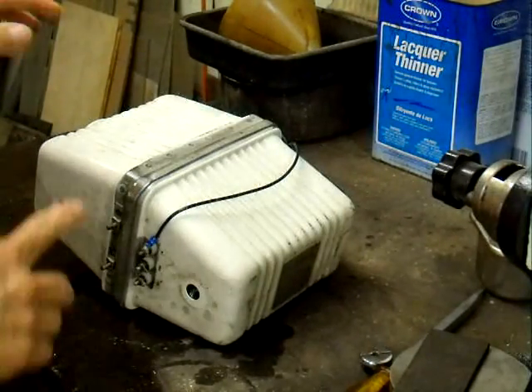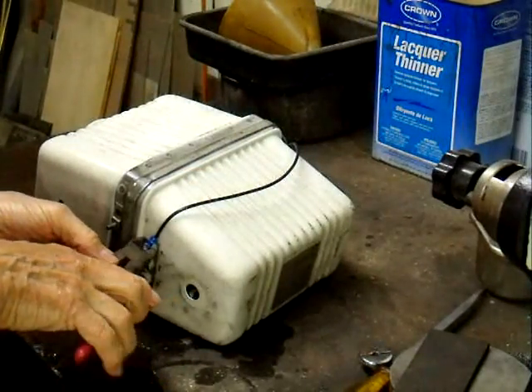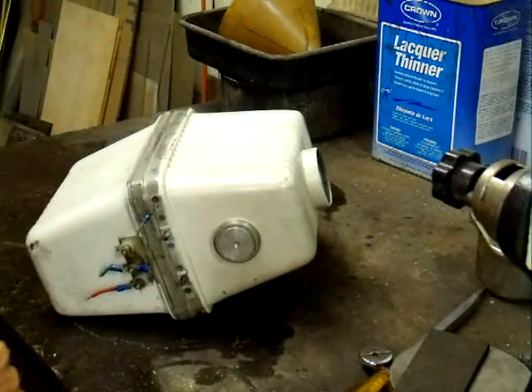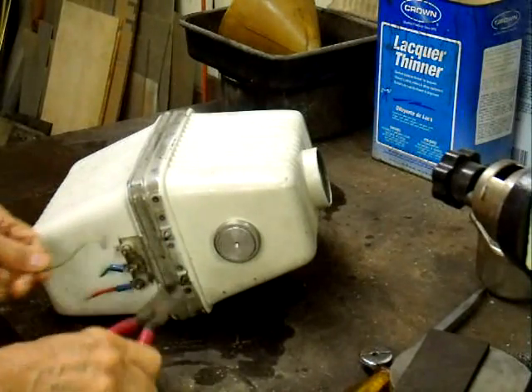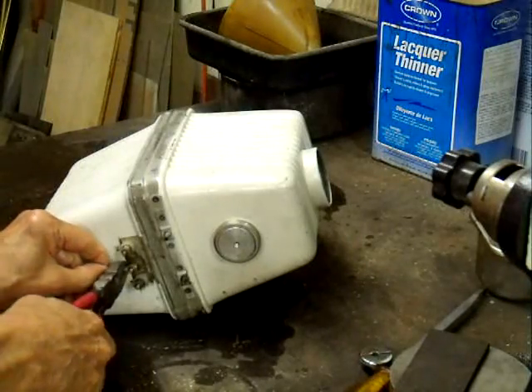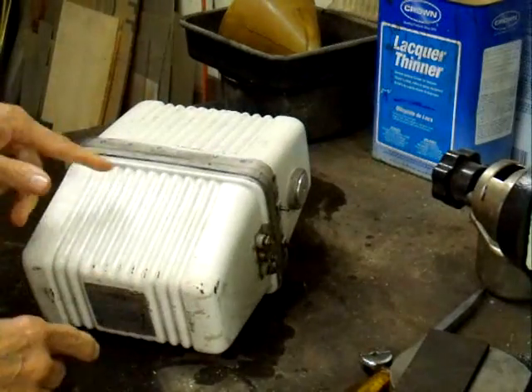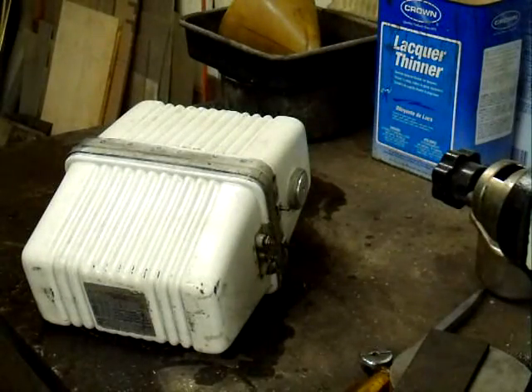To get it open we're going to have to chisel it open. I've tried heating these with a torch to get them open just by melting, and that is really quite a job. The only success I ever had was with two torches and a helper. What we're going to do is just take a chisel and cut that top bead off of there.